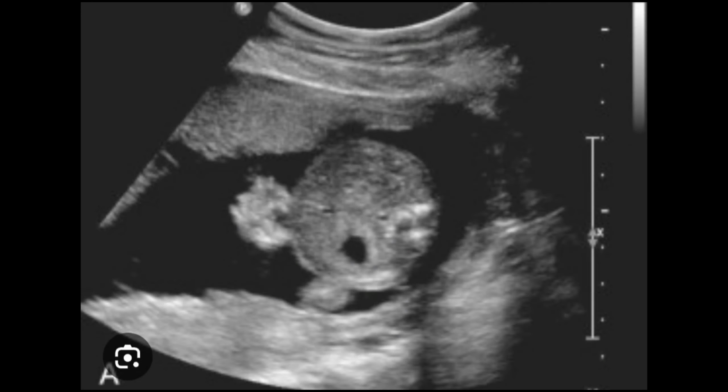Another example here: in the transverse view you can see intestinal loops coming out of the anterior abdominal wall, floating within the amniotic cavity. So it is quite easy to appreciate on ultrasound imaging, and you can easily pick this up and comment that the patient has gastroschisis.